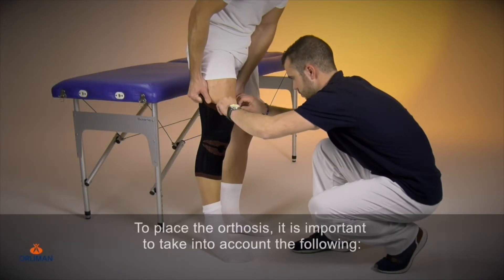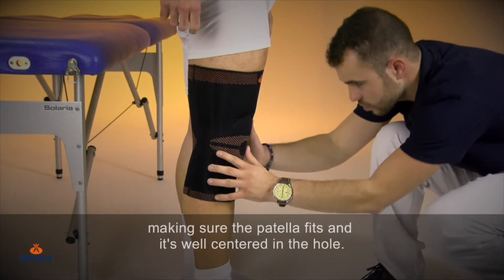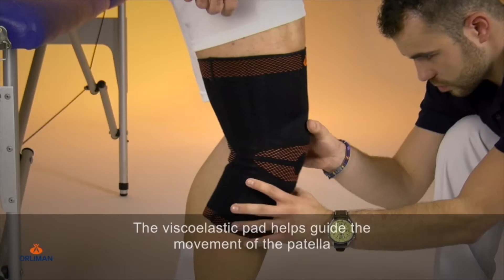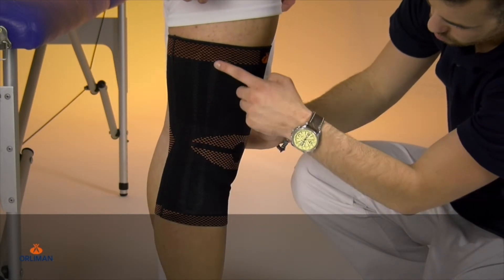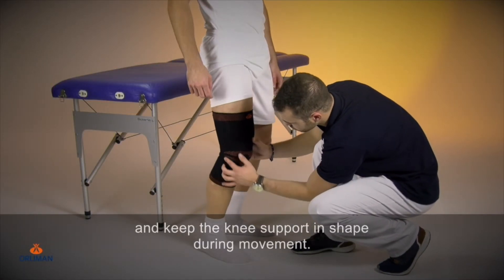To place the orthosis, it is important to take into account the following. We will slide the knee support up to the knee, making sure the patella fits and is well centered in the hole. The viscoelastic pad helps guide the movement of the patella and provides a massage effect. The lateral stabilizers provide more safety and keep the knee support in shape during movement.